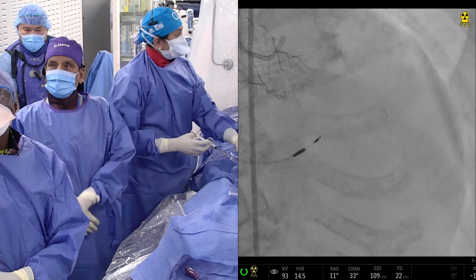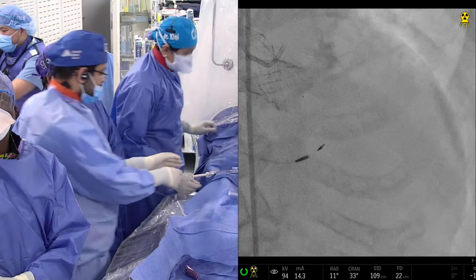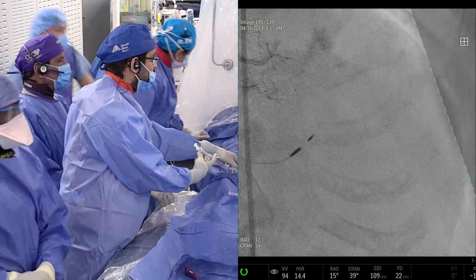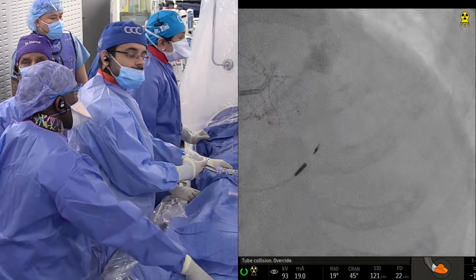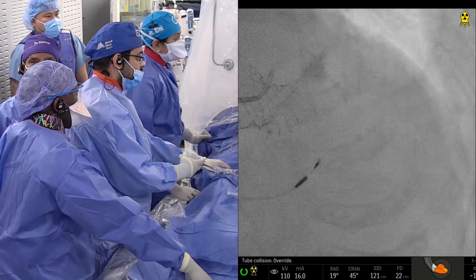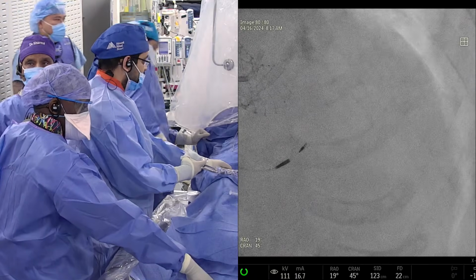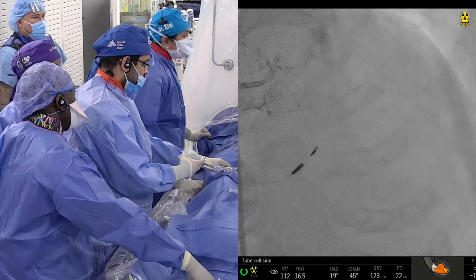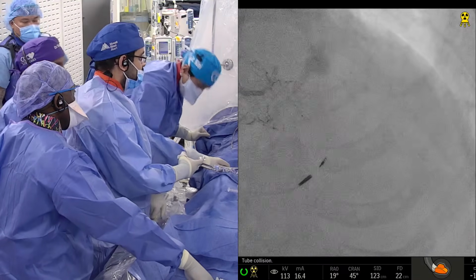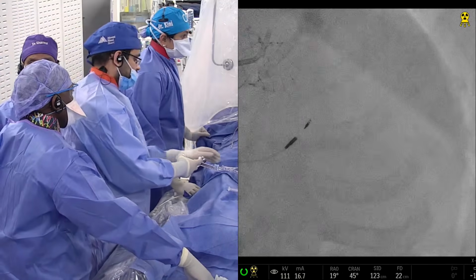But look at the calcium in that LAD. This is mitral, that's okay. But you have the nice calcium in the earlier view in the mid LAD at 1 o'clock, not at 12. That, by definition, is the tram track sign. The entire LAD is very calcified, which is not uncommon in patients of this age, when they already have calcific aortic stenosis and mitral annular calcification, and the entire LAD is clearly the ghost tram track.